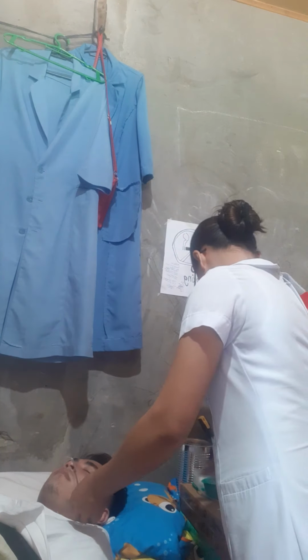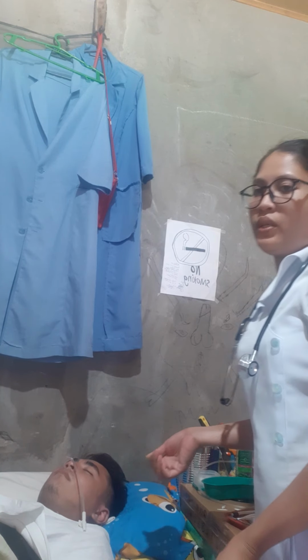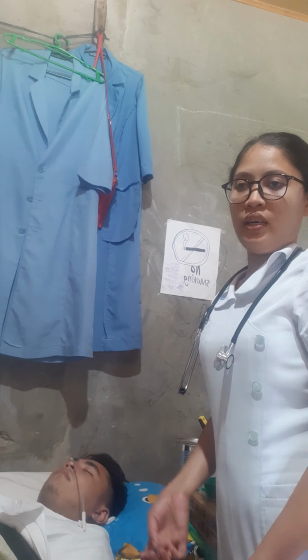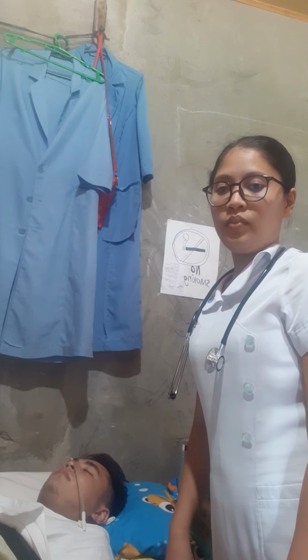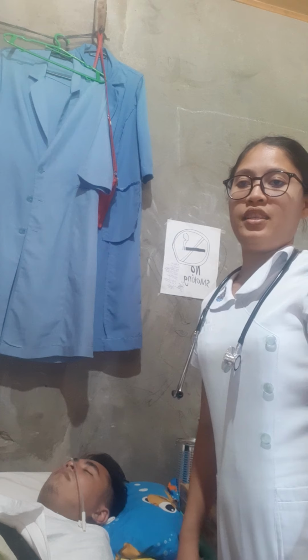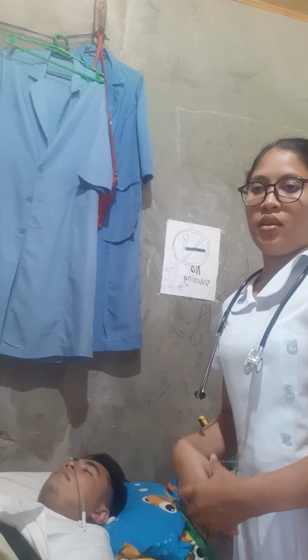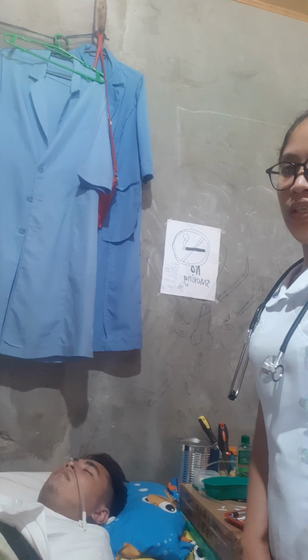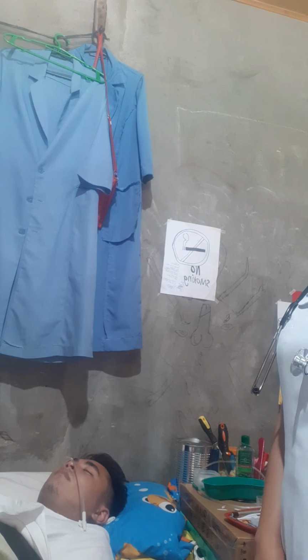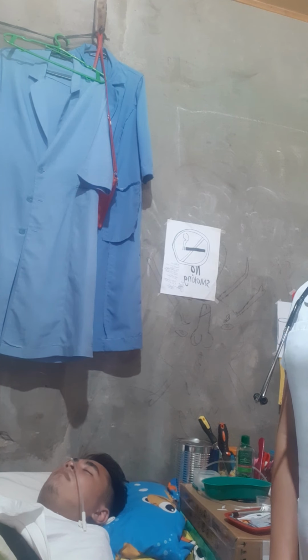Then next, for the feeding bag, we need to hang the bag of infusion on the pole, which is 30 cm or 12 inches above the tube's point of insertion into the client. Then we need to unclamp it to run the formula through the tubing and reclamp the tube, because the formula will displace the air in the tubing, thus preventing the instillation of excess air into the client's stomach or intestine.